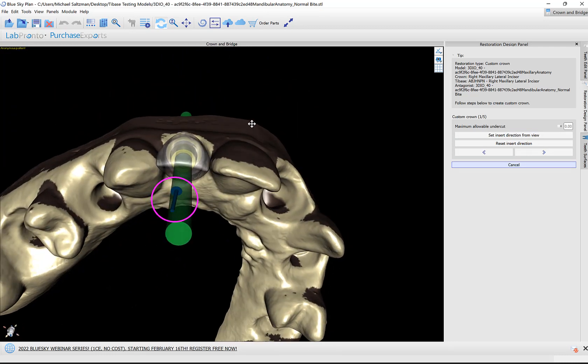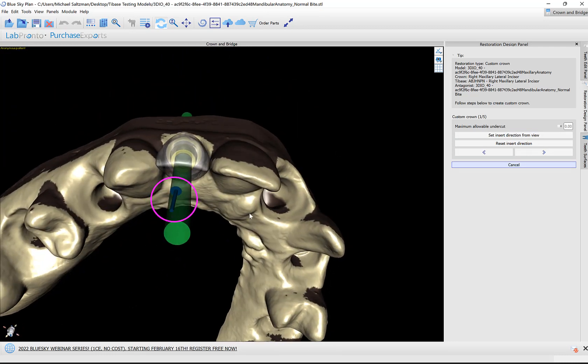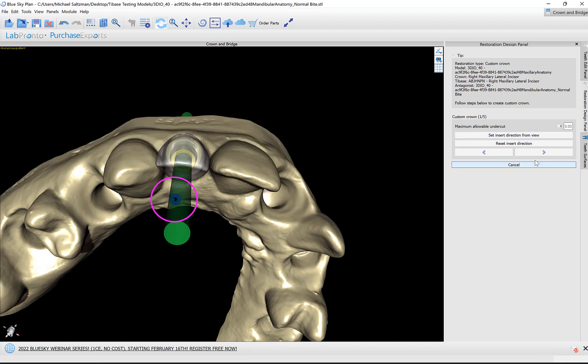The first step is the path of insertion. I'm going to set insertion direction from the view and then click OK.